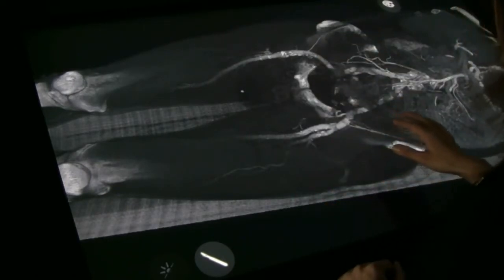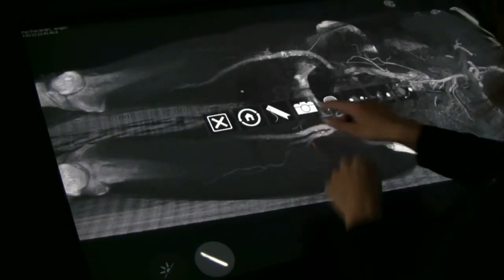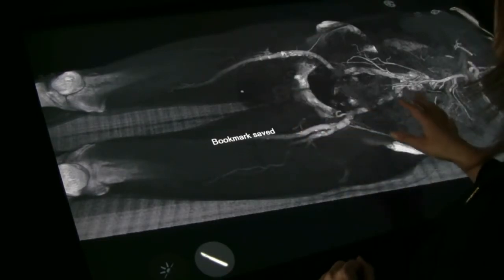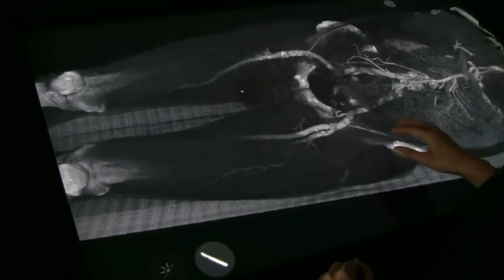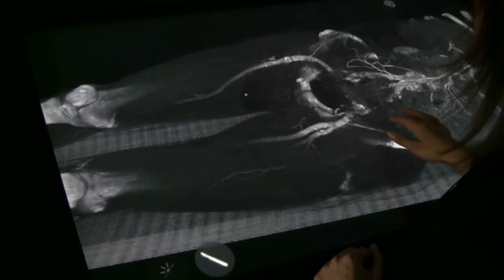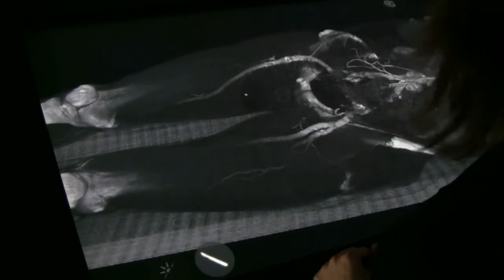And if you need to prepare lectures beforehand, you can easily do that by using something that is called a bookmark. The bookmark saves the current view of the volume, including any settings made. You can also create your own anatomical library arranged in the way that you prefer. The system is very flexible and it can be configured in many ways.